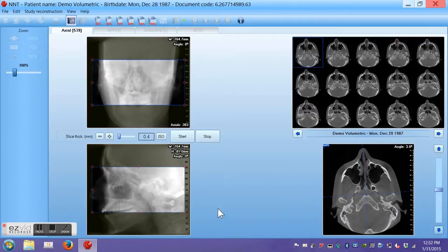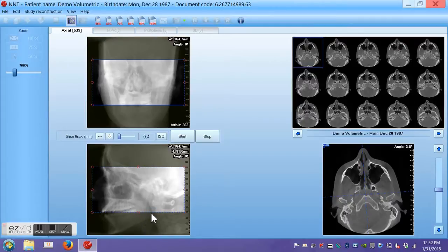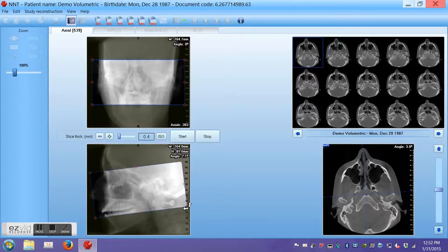Next, I am going to look at the sagittal section. You can see that part of the image is illuminated and part of it is not. I am going to use the bottom line of the illuminated portion to orient this box parallel to the occlusal plane. By moving my mouse to the corner of the illuminated image, I can rotate the box and use the bottom line to parallel the occlusal plane.